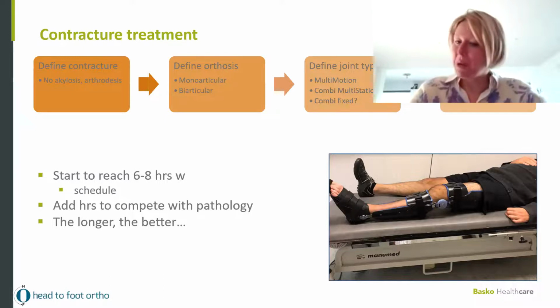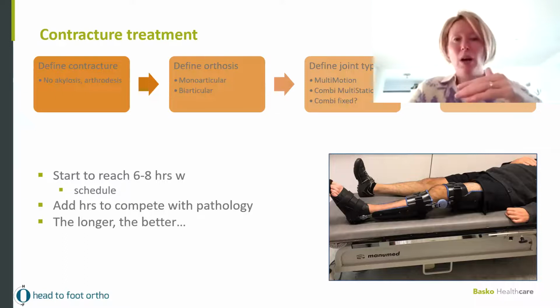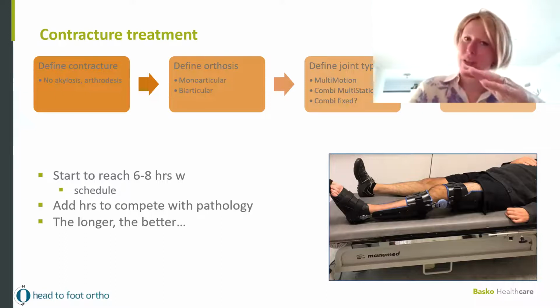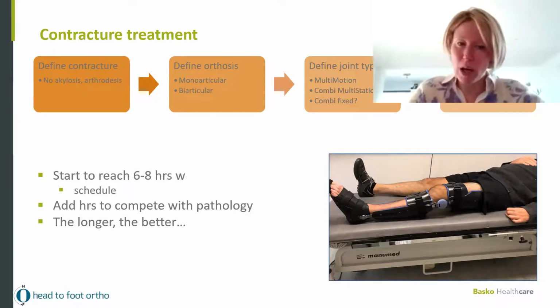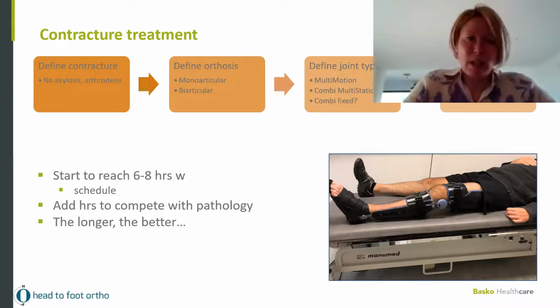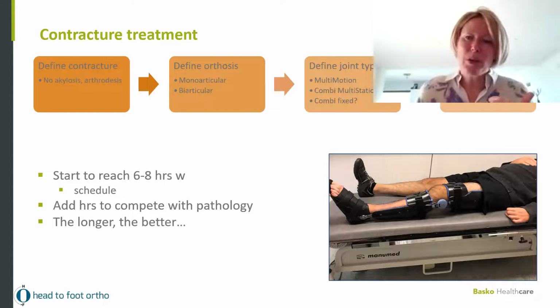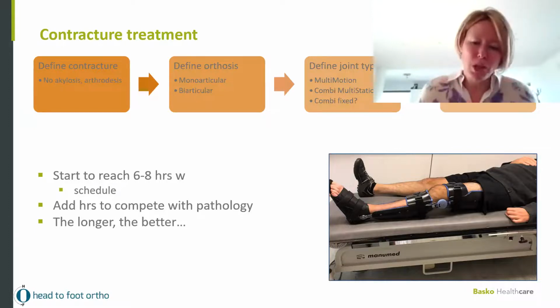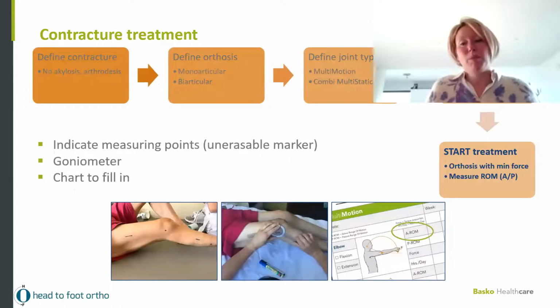And if the person says, yeah, well, I can easily sleep in it, or you have patients that say, I cannot sleep, but I wear it from 6 o'clock in the evening, when I'm lying on my couch, until 11. And then in the afternoon, I put it on 2-3 hours more. I feel the benefit. Well, I'd rather have that than somebody who says, I don't wear it at all. So you like the patients to wear the orthosis, you increase the wearing time, and once you've achieved that, you can really start your treatment.